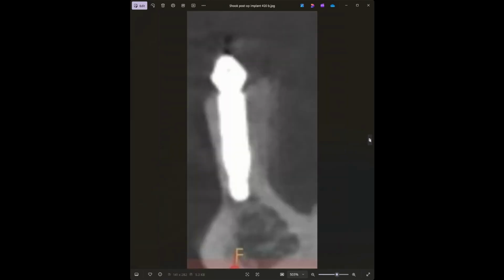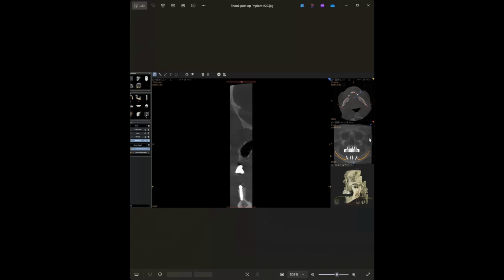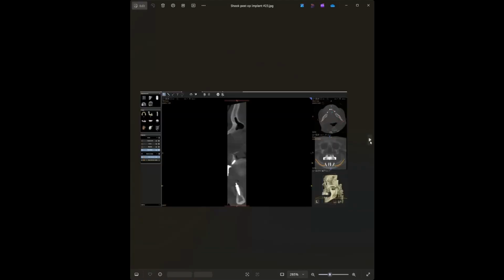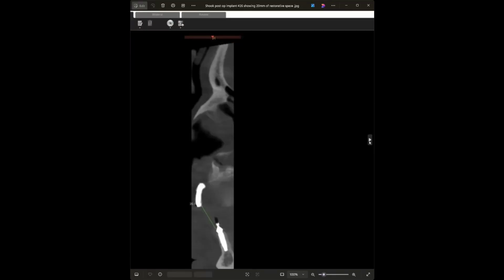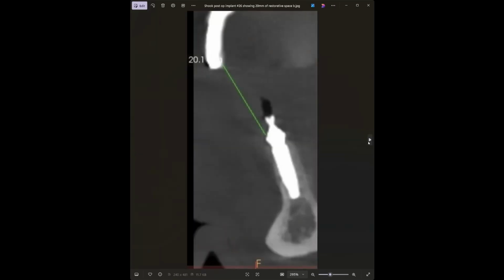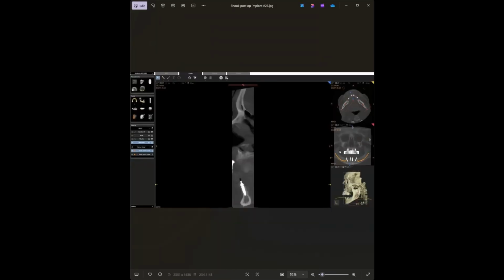Take a look at the implant placements. Looks like that's the tilt, number 20, probably in the anterior. Looks like number 26. I'll blow that up for you. This would probably be number 20. I think it was still in the anterior there. So you get to see everything turned out really, really well. So that's it. That's our workflow for the mandibular fiducial.